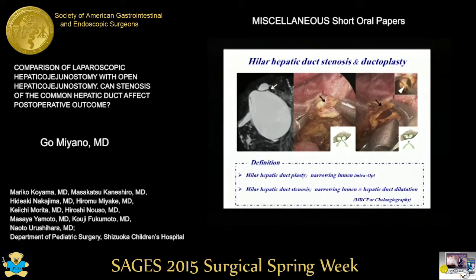We've been focusing on hilar hepatic duct plasty to prevent postoperative complications. The common hepatic duct is further resected at the confluence of the hepatic duct, and if indicated, we make a transverse longitudinal incision along the hepatic duct confluence from the hepatic hilum to the bilateral hepatic ducts to obtain sufficient drainage and a large anastomotic stoma.